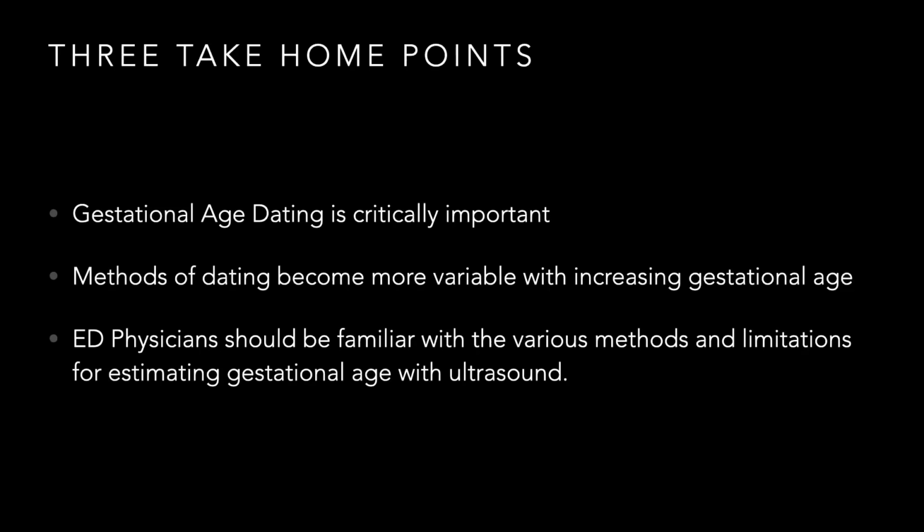And number three, more of a big picture concept, is ED physicians should be familiar with various different methods and limitations for measuring gestational age. And I would probably even broaden that out, given our introduction, that physicians who interact with pregnant women who do bedside ultrasound, not just ED physicians, should really be familiar with this, because this is basically bread and butter OBGYN outside of the OB office, right?